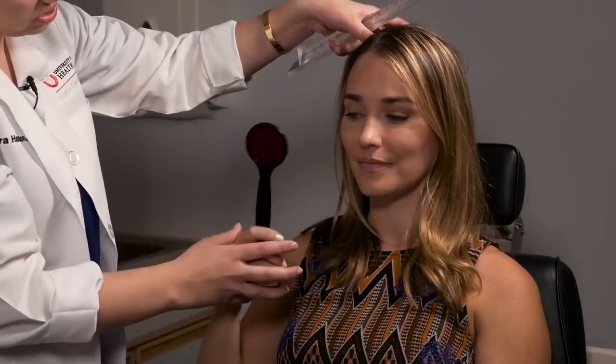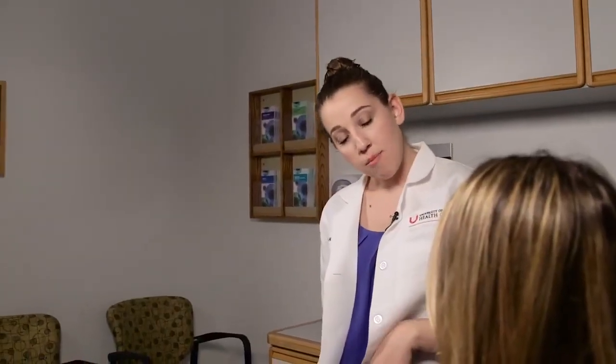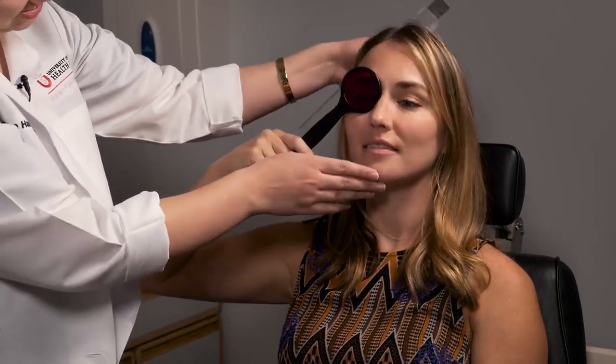So now we're going to turn, there you go, turn your head. Good, so this is measuring her in left gaze, so go ahead and look back at the light. Is the light above or below the red line? It's right on it. Right on it, so perfectly aligned there. And how about there, in right gaze? Right on it. Very good, you can also do it in down gaze. Exactly on it. And up gaze. Right on it.